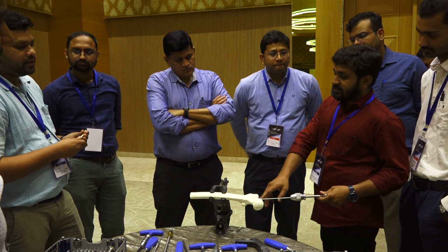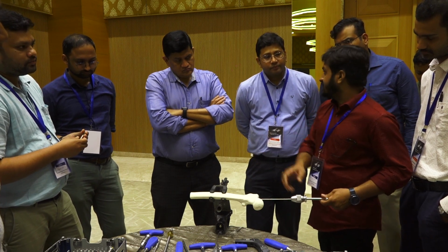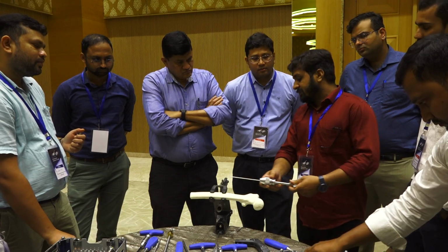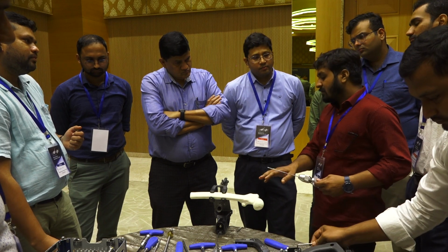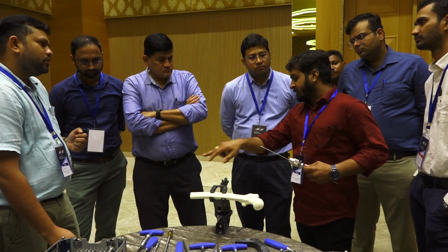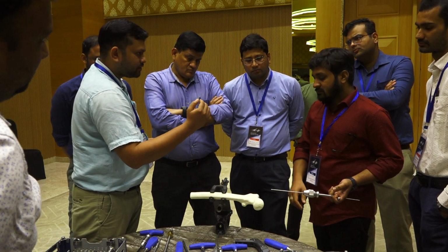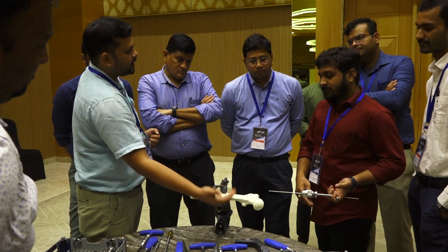I am not trying to reduce with the nail, sir. After reduction only, after passing the mid shaft, I am trying to centralize the nail anteroposteriorly in the distal portion. Sir, after crossing the mid shaft, by slightly lifting the jig, I am directing the tip of the nail, which is going anteriorly. I am redirecting it slightly posterior. So what you are doing, you are rotating this part. As a whole, this part will rotate anteriorly. Correct? And then the neck and head will sag into the posterior part.